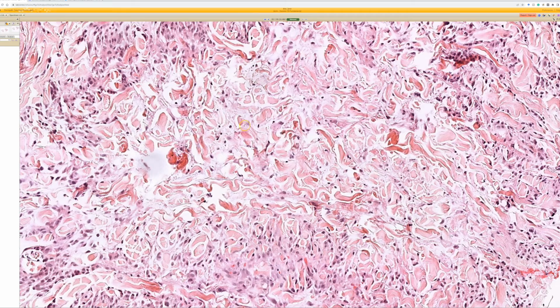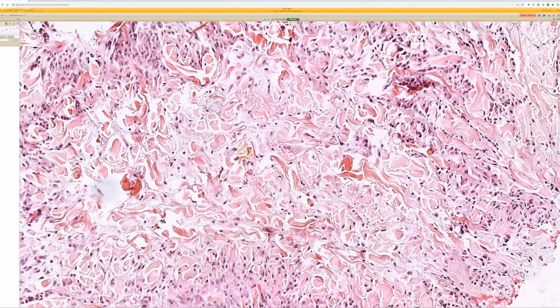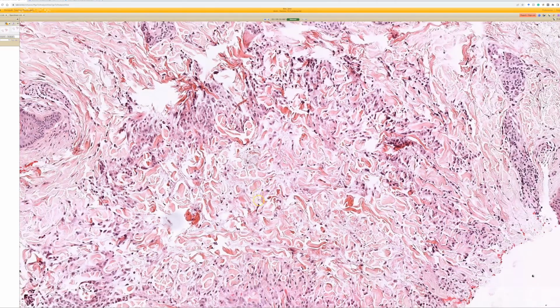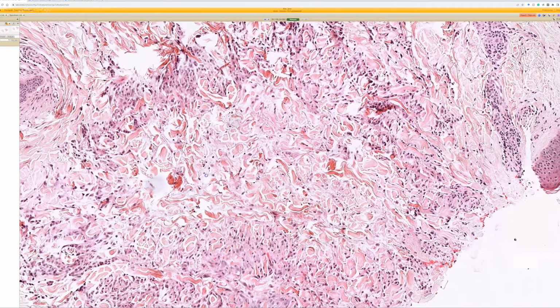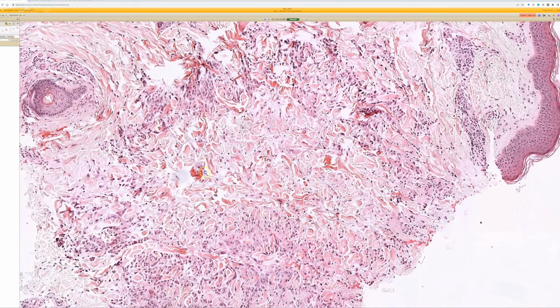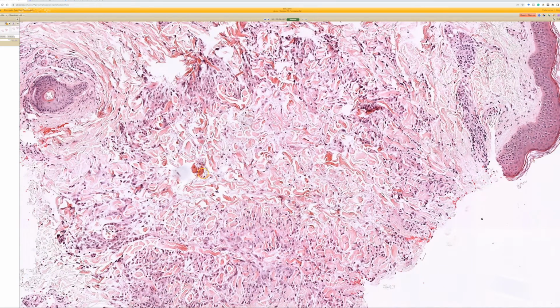As I said earlier in the full video of this session, dermatofibroma, despite having many, many morphologic variants, myxoid is really not one of them. I've never seen a really good example of a DF with abundant myxoid change. I've rarely seen focal myxoid or mucin change, but very rare and very focal. So DFs have a lot of flavors, but myxoid ain't one, okay? If you think it's a myxoid DF, you better go think of some other things first, like scleromyxedema, like we talked about earlier, or like GA.